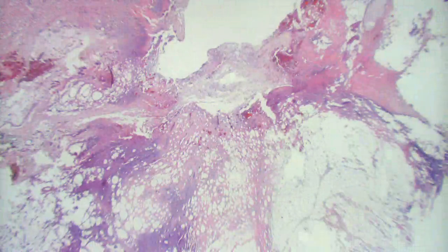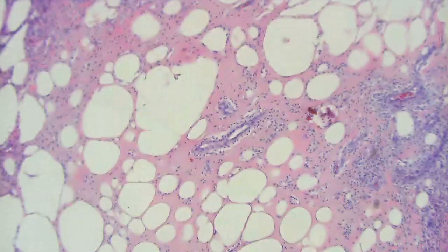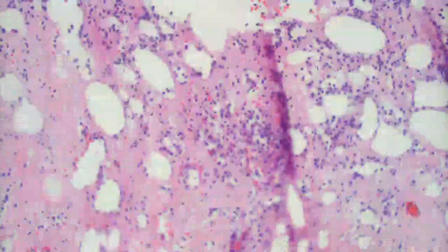And you can see that there's areas of the infiltrate that's darker, lighter. So it tells you that it's probably a mixed infiltrate. Yeah, it is a mixed infiltrate. And there's areas of necrosis too. What's necrotic? It looks like the lobules. Yeah, the fat's necrotic. It's kind of hyalinized. What kind of cells are in here? There's neutrophils, lots of neutrophils. Probably some histiocytes in there, a few, but it looks mostly neutrophilic, acute necrosis.